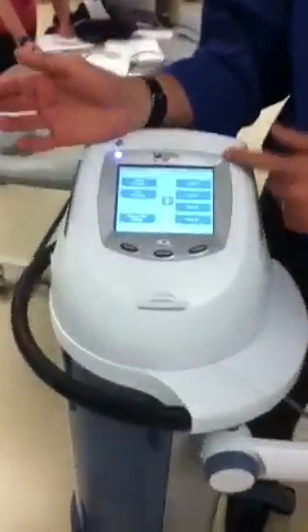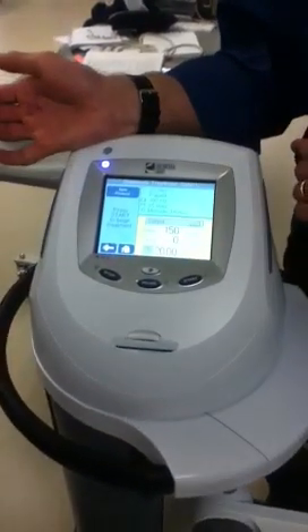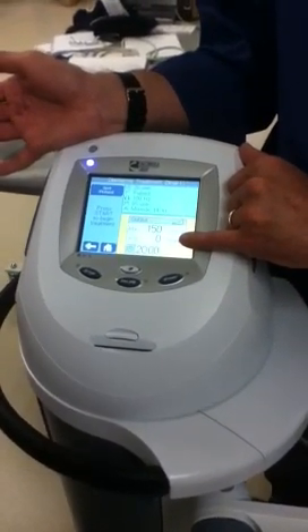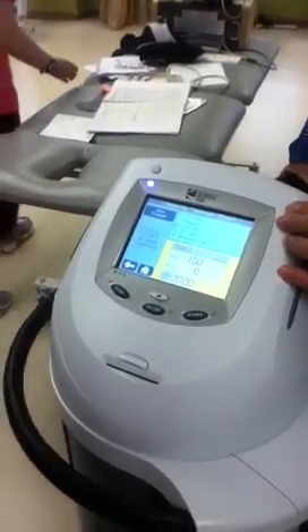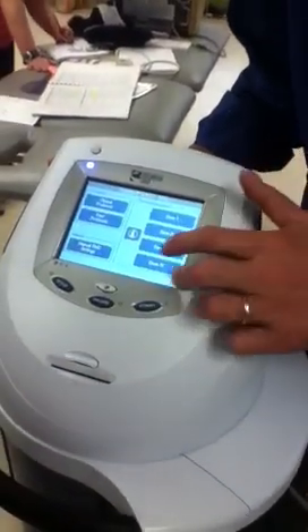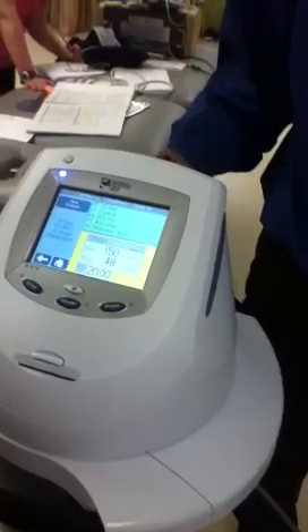When you come look at this machine with me, this one is nice because it has preset choices — dose one, two, and three. If I push dose one, my max is 150 watts but my average is zero, so dose one is non-thermal. Dose two, my average watts are 12 — not fully thermal, but some thermal. When I get to dose four, my average watts is 48, so the result is thermal.